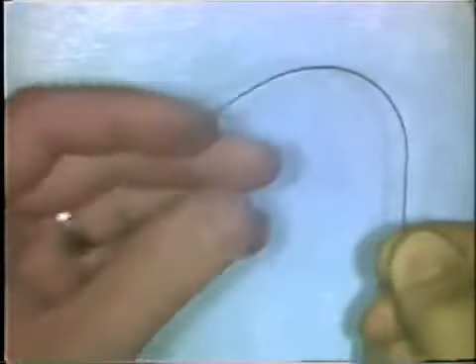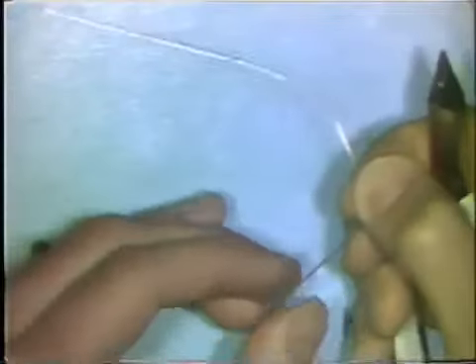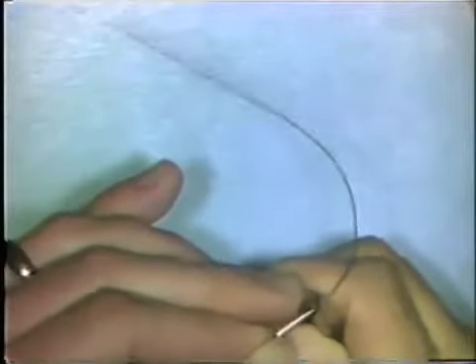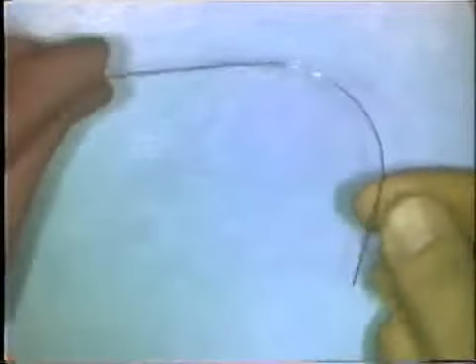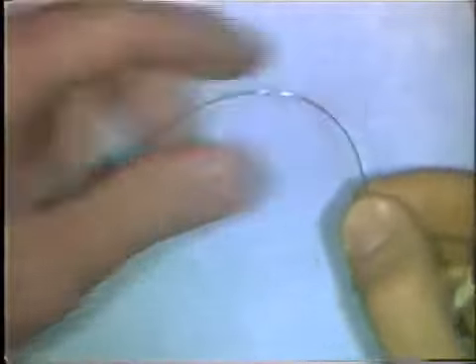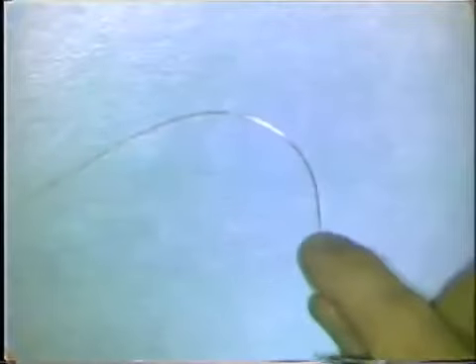After you've done this, you can adjust the curve using the method of flattening the wire with the base portion of the plier, or adding small bends as needed to adapt it to the labial surfaces of teeth or to the pattern that you want to adapt the curve to. It's necessary to flatten out curves in wires to make sure they're in the same plane of space.